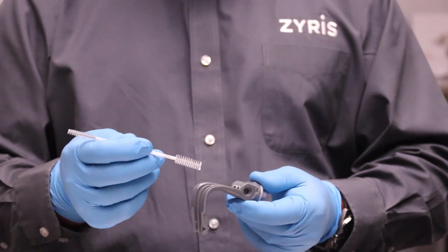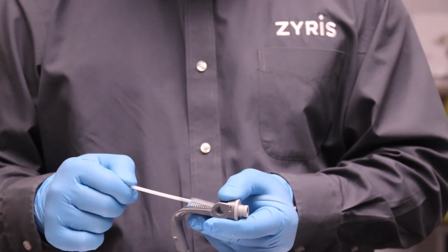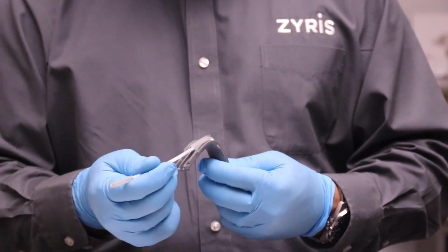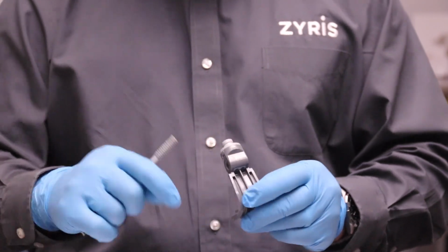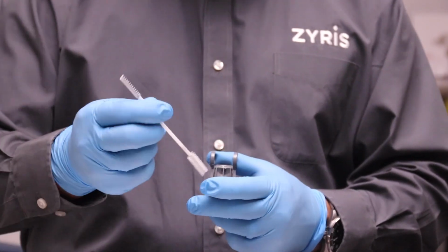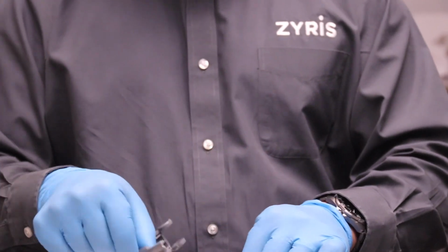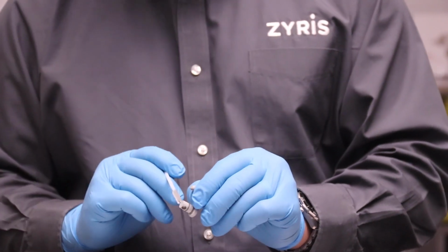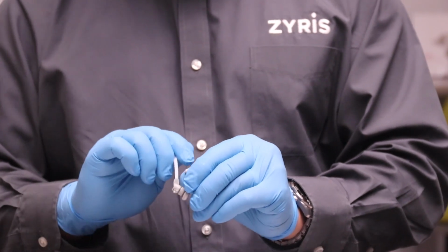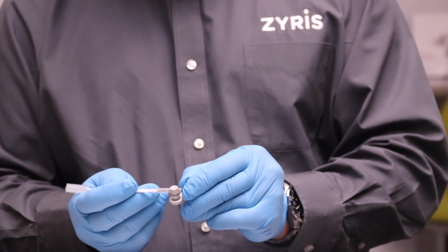Now you can take your double-ended cleaning brush and using a pH neutral solution, clean all of the channels, nooks and crannies of the control head, ensuring that no material or debris is left inside the unit so that it can be put into the autoclave bag. Don't forget to also clean your levers. There's a whole evacuation channel on it. Make sure that you remove any debris or materials inside that too.